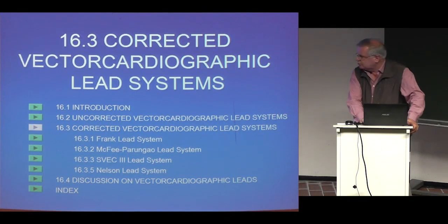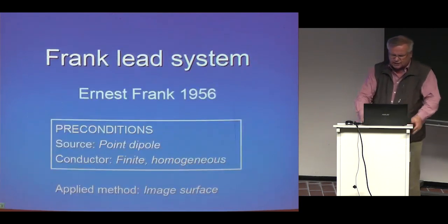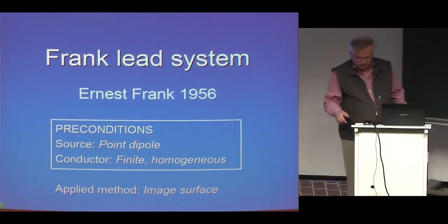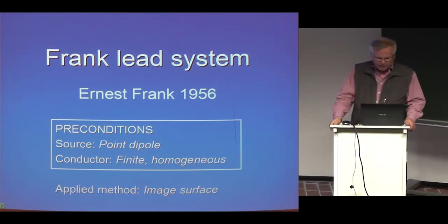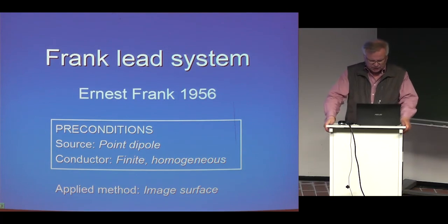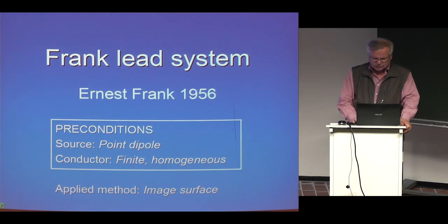Now I go to the corrected vectorcardiographic lead systems, and I think I'm able to present and show the Frank lead system. The Frank lead system is the vectorcardiographic lead system which is still used in cardiology. Ernest Frank published it in 1956, and his preconditions for the system were a point dipole for the source and a finite homogeneous volume conductor. He applied the image surface method in designing this system.